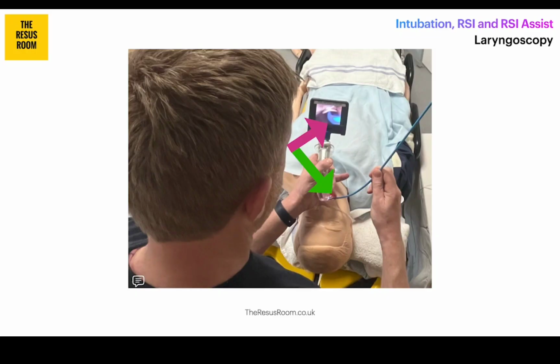Again, don't rush. Creep down with the blade, with suction ahead of the blade if there's any secretions at all, or blood and vomit, to make sure you don't obstruct the camera. And I think you need to have a really good justification as to why you're not going to use suction in an emergency unprepared airway.